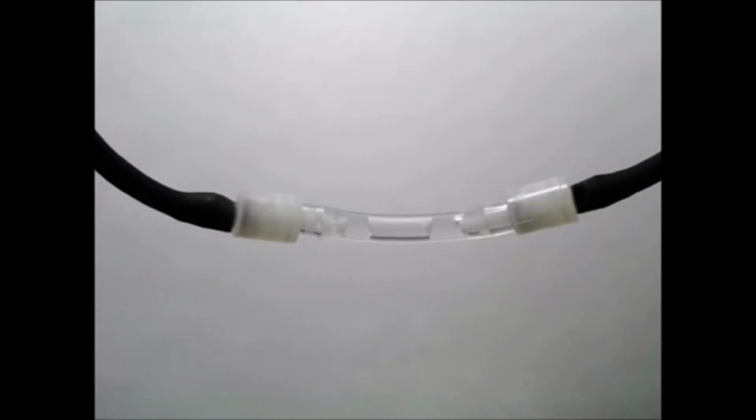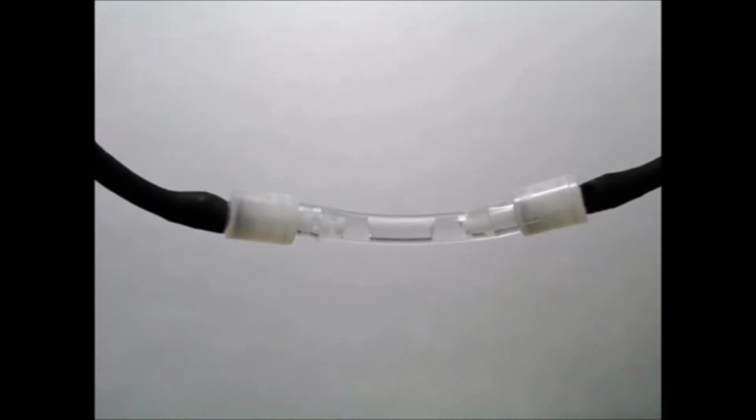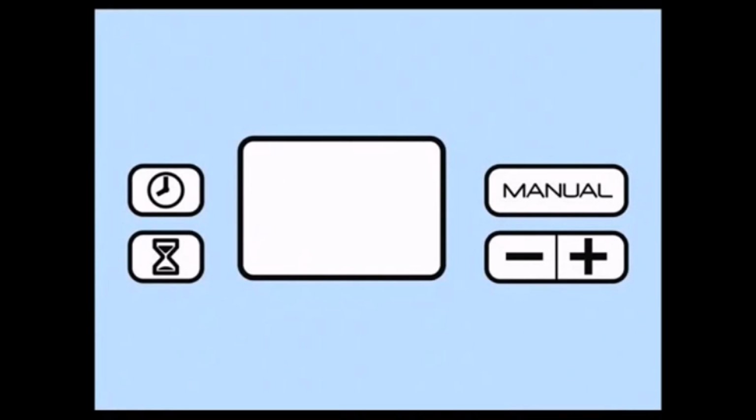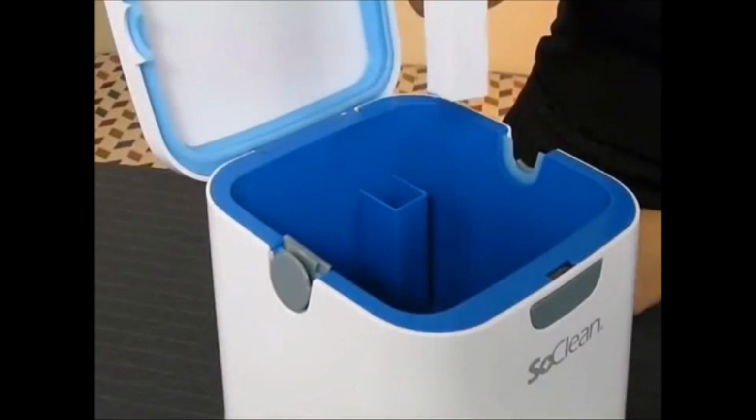If you can see water in the clear section of tubing, you should replace the check valve assembly. We recommend regular replacement of the check valve assembly at 6-month intervals. To assist you in this, your display screen will flash reminders to make this replacement when that time has arrived. Another item that we recommend replacing at the same time is the filter cartridge.